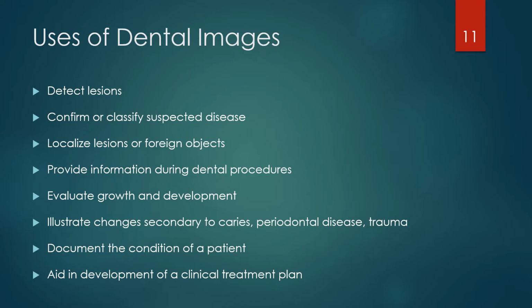Dentists should have to weigh the benefits of taking these dental images against increasing a patient's exposure to radiation, because we do want to expose our patients as little as possible while still being able to do all of the things that we have here. These are all important factors to keep in mind when your patient is against having those dental x-rays taken.